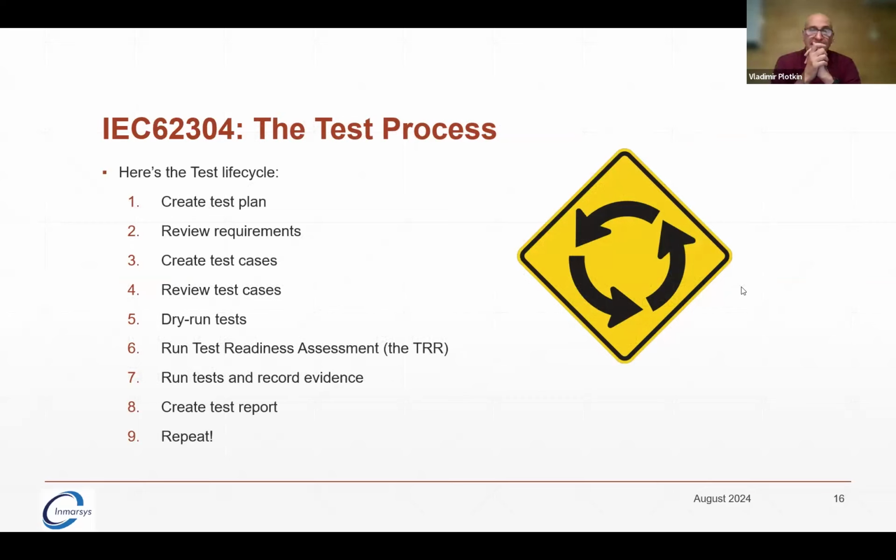A couple of words about testing. So the test life cycle is very simple. As I said, they need to create test plans, because they have lots of different plans: the V&V plan for the overall system, the integration plan, the software item test plan. They need to review requirements. It's very good practice to invite them to all requirements discussion meetings, because it will be an instant response whether they can test it or not.